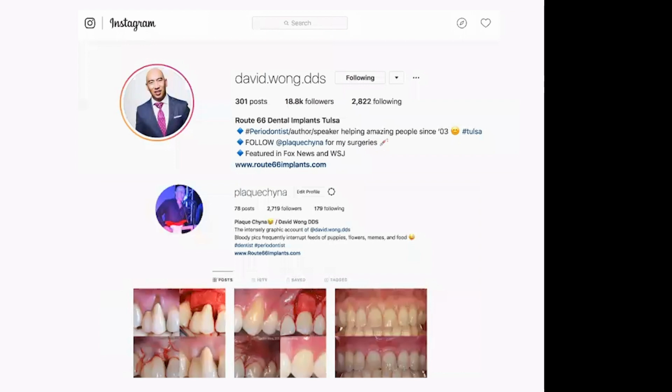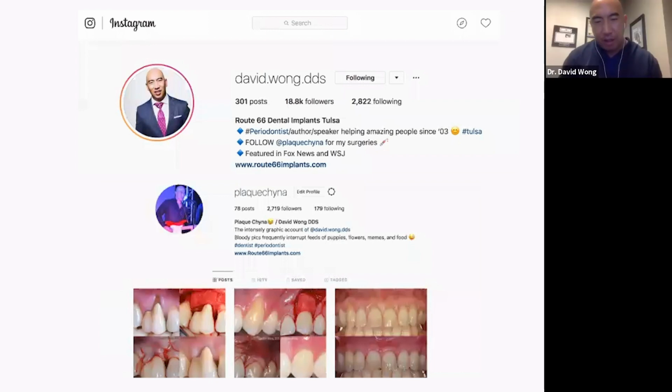Can you explain the tunnel flap for treating peri-implantitis? Yeah. Sorry, what a tunnel is, you're going to utilize small instruments. You're basically making sulcular incisions and you're going to release the tissue through the sulcus, or a small incision or a hole, distal and away from the site where you're actually doing your surgery.